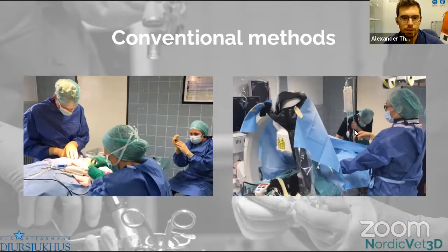On the left image, we can see several people need to help us when we do guiding and to determine the guiding angles. And on the right side, we can see fluoroscopy machines, which provide us live radiographs, but they also cause scatter radiation, which is a big health issue. And if we want to reduce these things, we can use 3D instead, according to me.